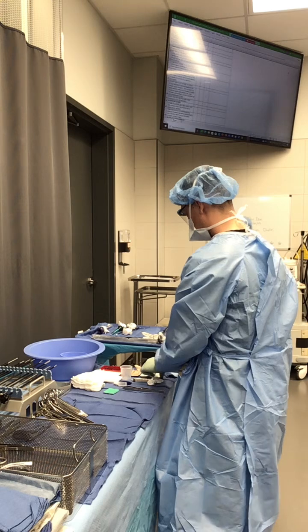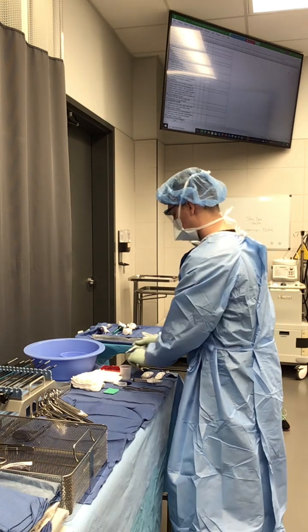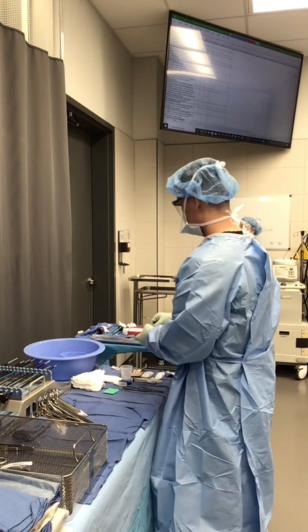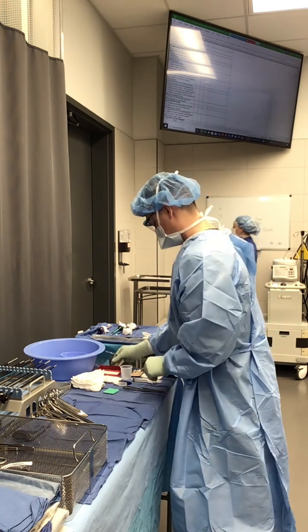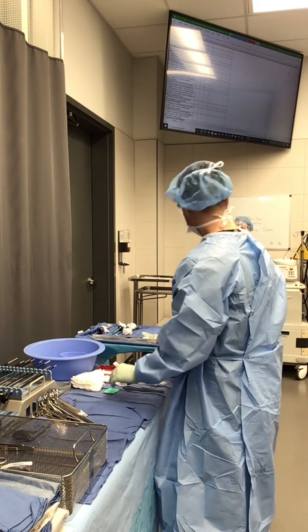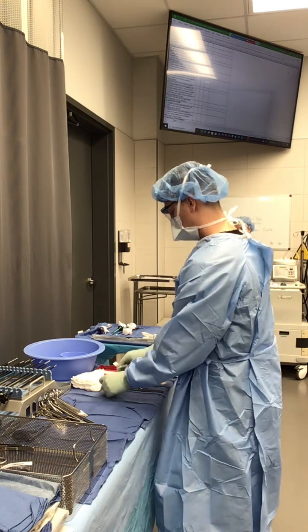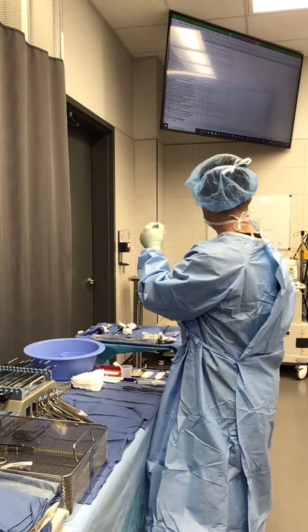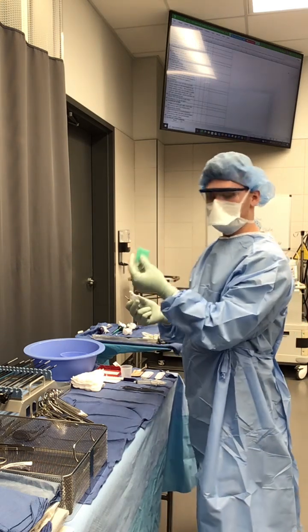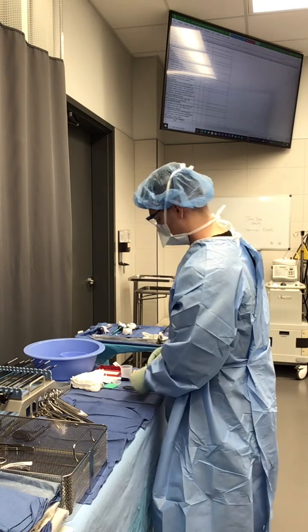Next, I have atraumatic needles: one, two, three, and four is in my needle book. Knife blades: I have one. One syringe: I have one. One hypo: I have one. Marking pen: I have one. Prep: I have one, two, and three — so three pieces total. I'm counting the bottle and the cap each as one, and then the sponge, so a total of three. That is our soft count.